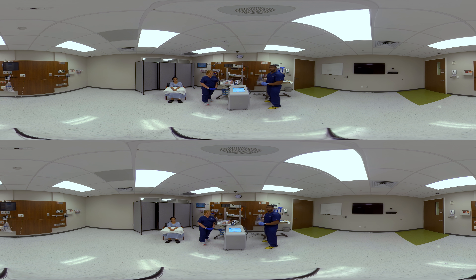Over time, you'll also see a lockout screen, or you can hit the lockout button here. On the lockout screen, you can see your patient temperature, the water temperature, and the trend indicator will be in the bottom right-hand corner. To exit the lockout screen, you'll just hit the button in the upper right-hand corner.